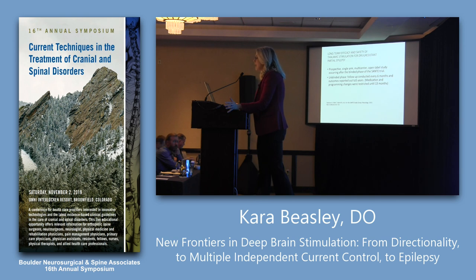So then they did a prospective single arm, so everybody's getting stim, multi-center, open label follow-up for Sante. It was the unblinded phase, and they conducted it every 6 months, and they reported outcomes out to 5 years. And here's the exciting part about it, which is what I'm going to show you. It just gets better and better.